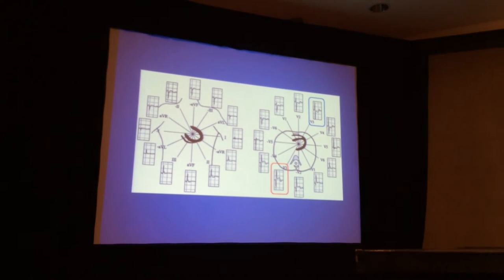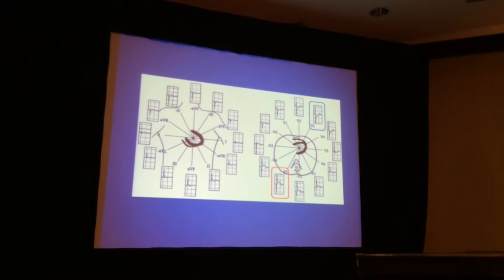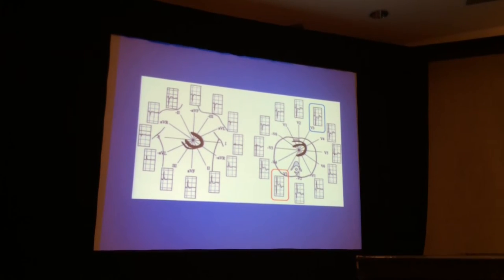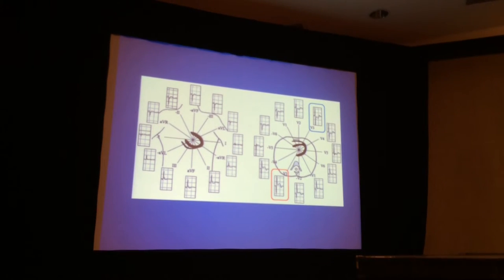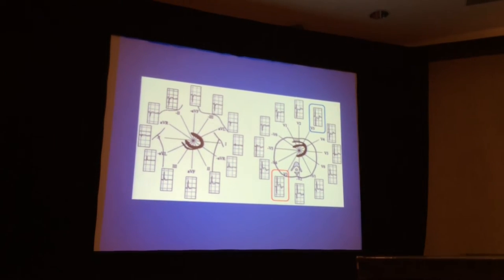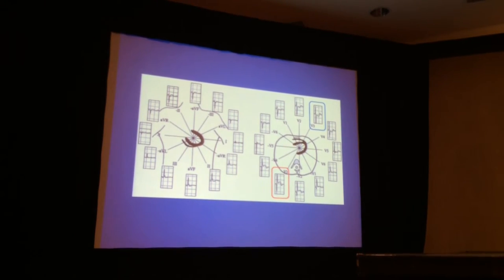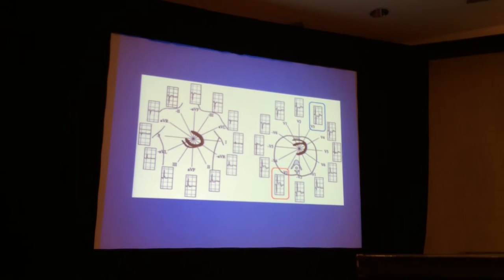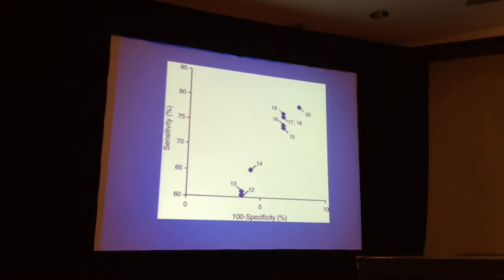So this patient is indeed having an ST segment elevation infarction due to an occlusion of, guess what, a non-dominant left circumflex. But it happens to be an occlusion someplace that's not going to show ST elevation in even one lead of the standard 12, let alone two contiguous. But if we don't pay attention to this, we're going to say, oh, this patient's not having a STEMI. This patient's having something else. Let's not even think about this patient with chest pain as having an acute occlusion. So it's another place where, in fact, expanding from the orderly sequence of considering just the standard leads to around the clock, one does have added value in the electrocardiogram.